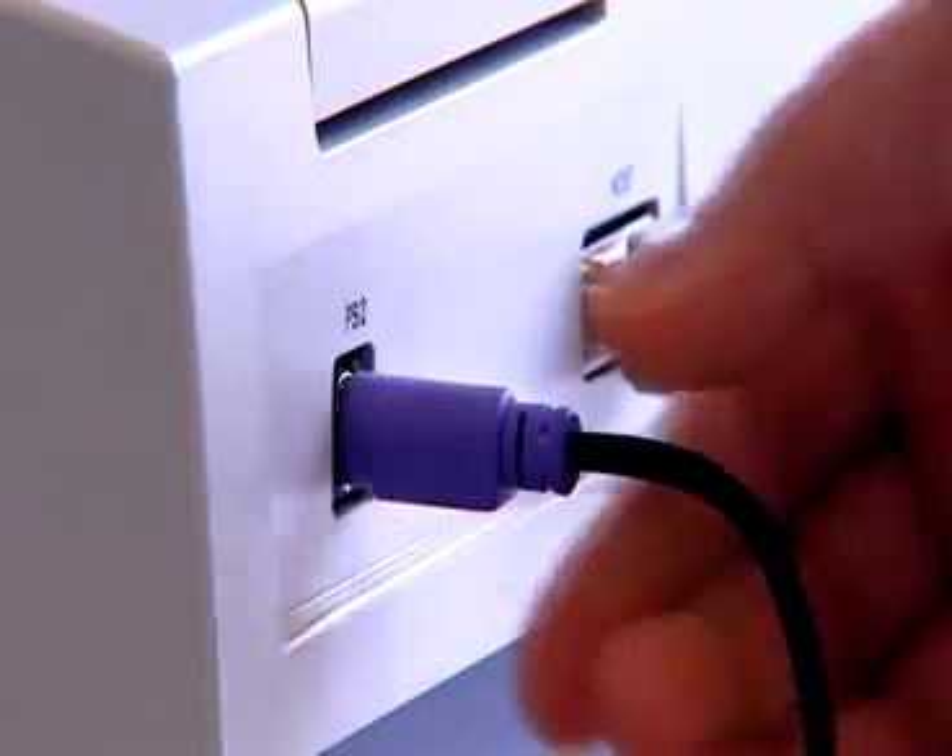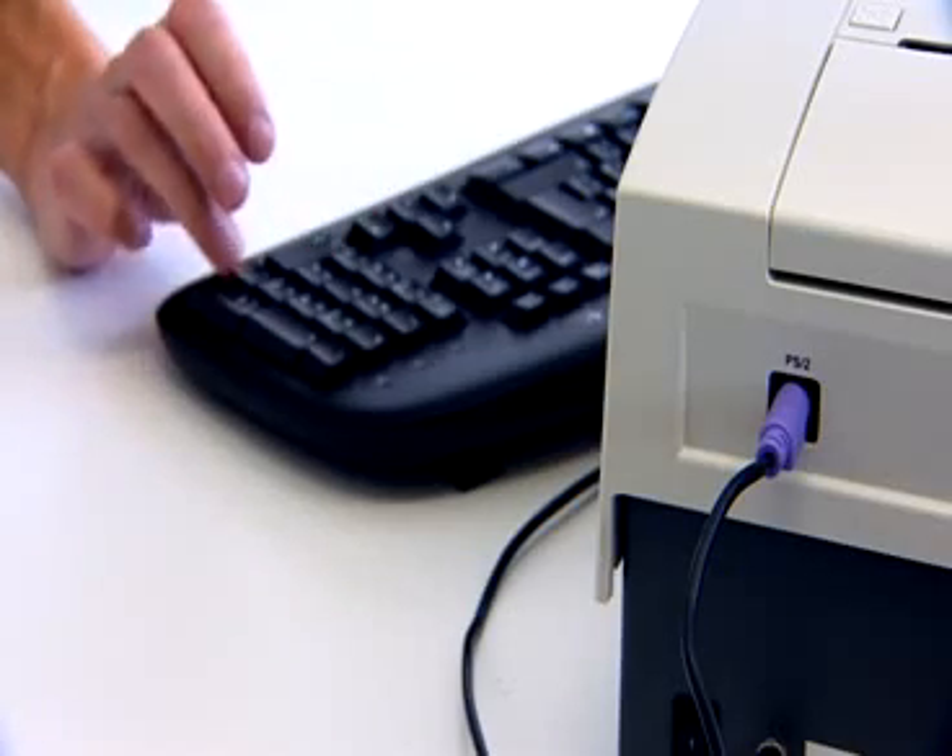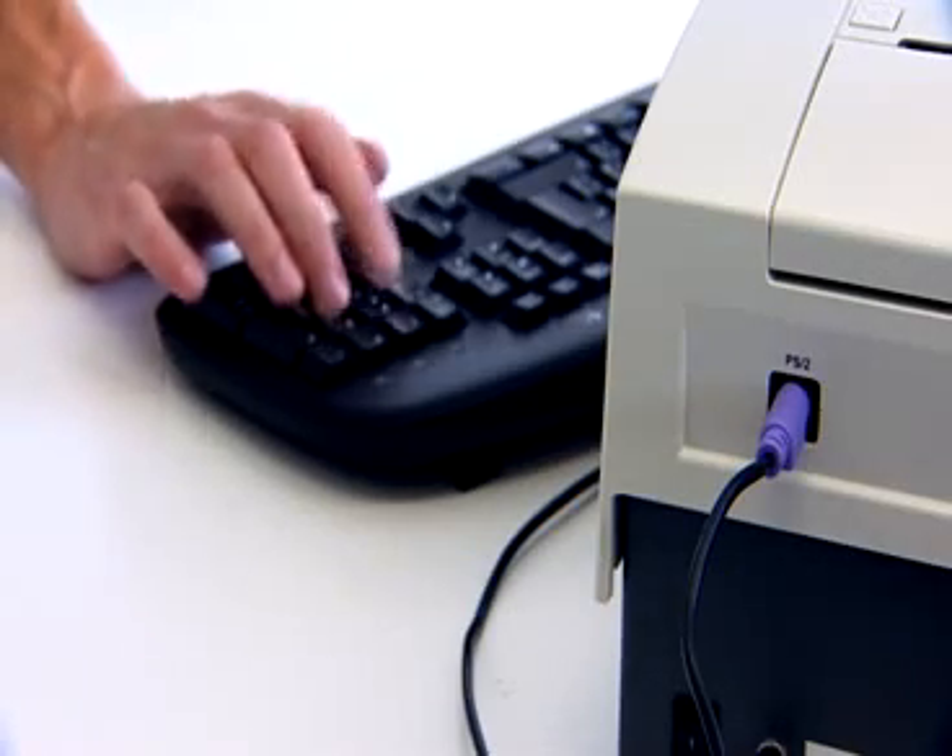Connectors for an external keyboard or barcode reader, and a connector for the laboratory IT system or PC, come as standard.